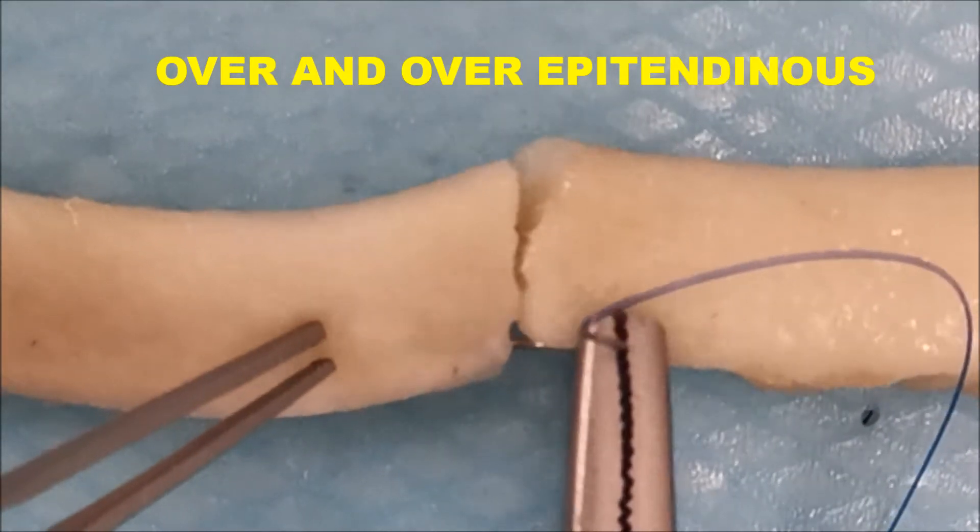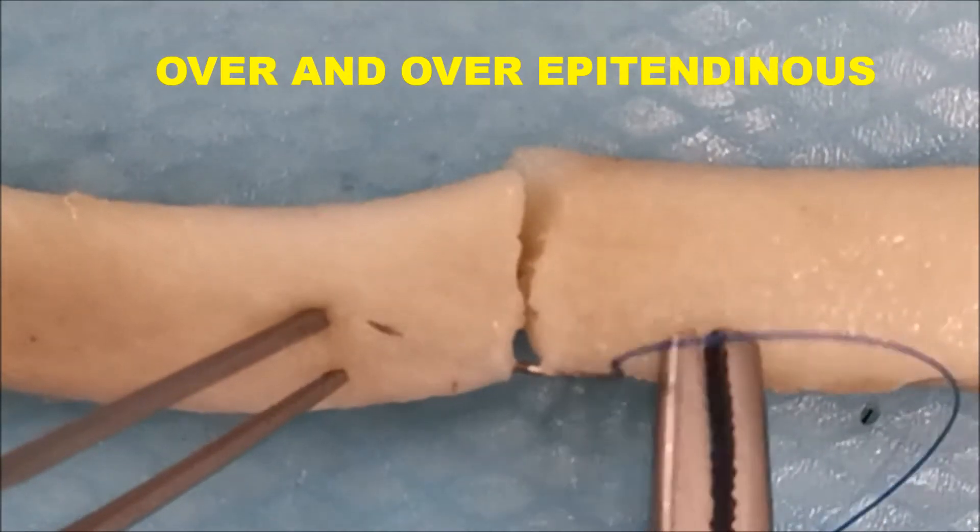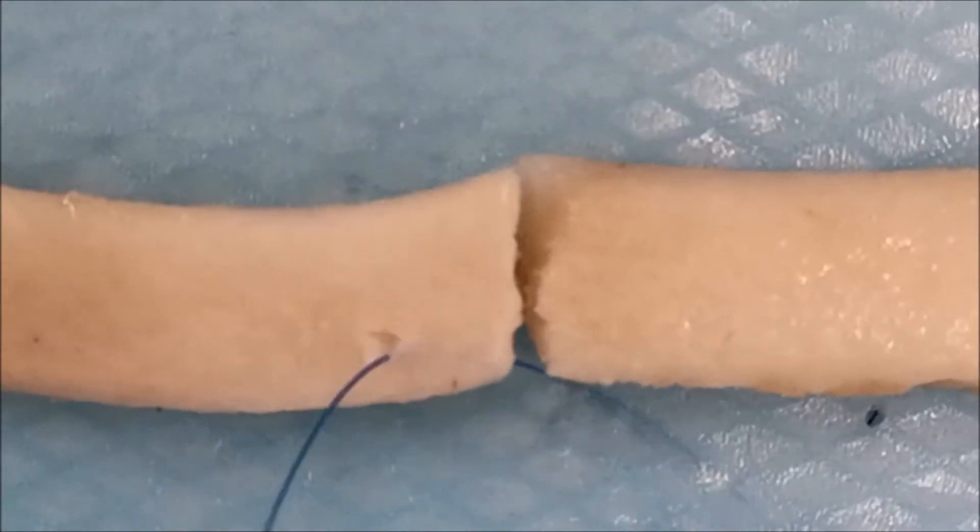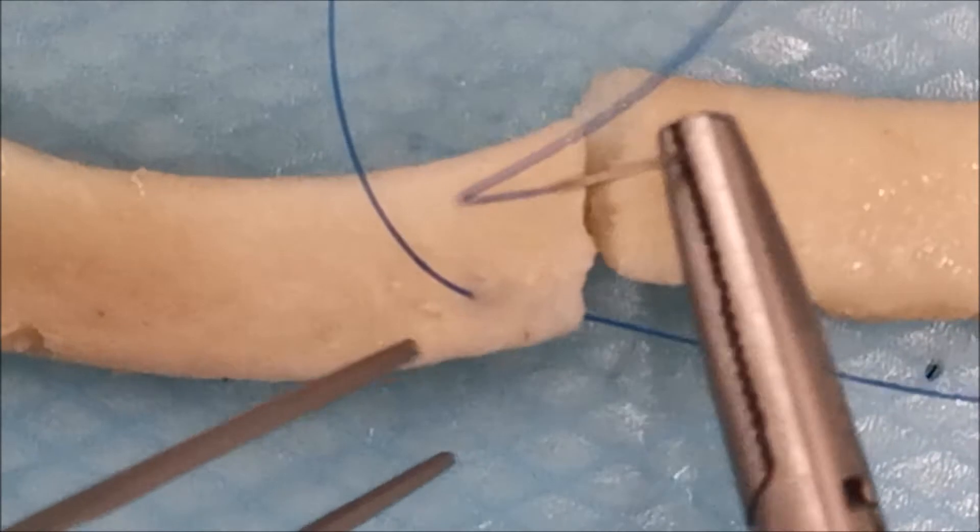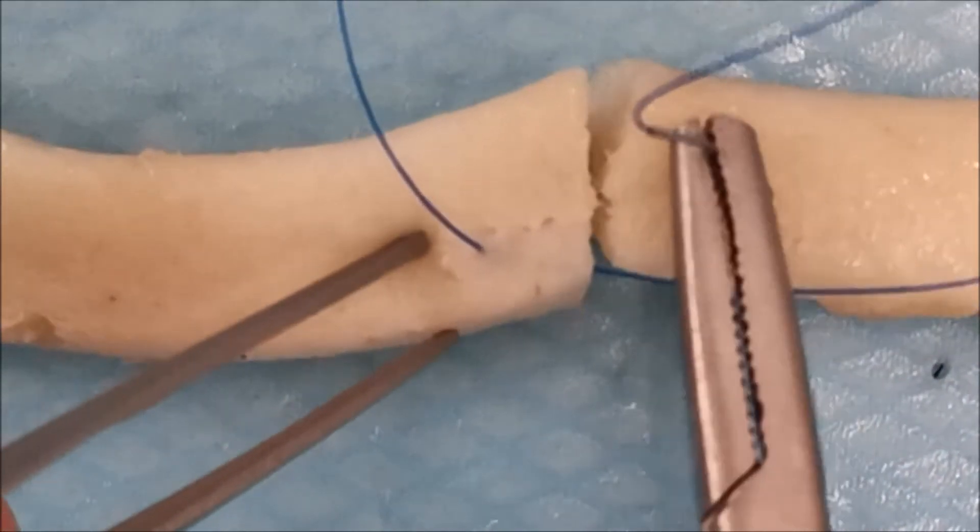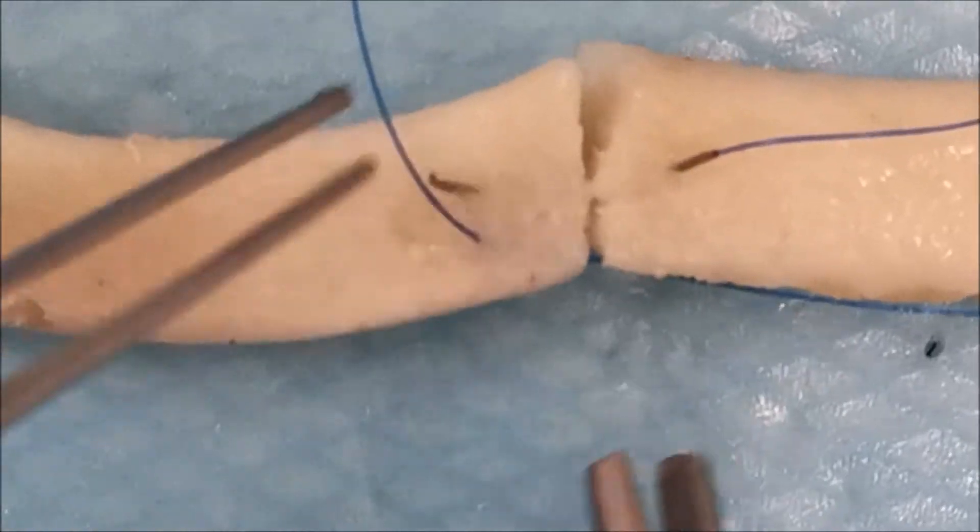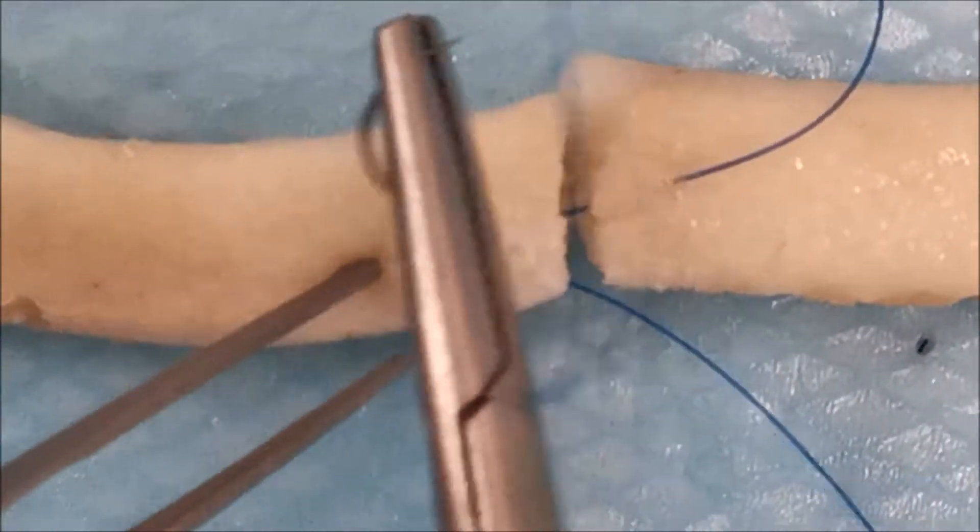The over and over epitendinous is just a simple running suture. You are just taking the epitendon and be careful not to go too deep as to injure or damage your core sutures.